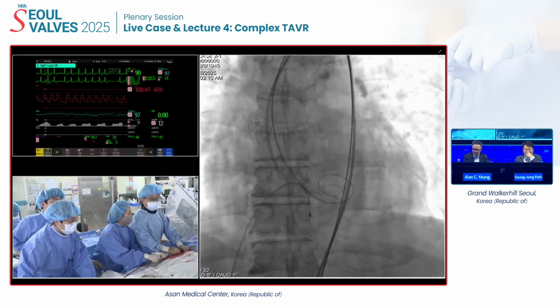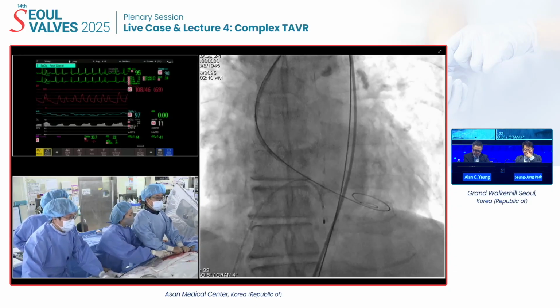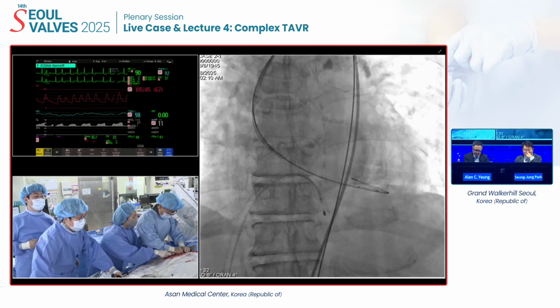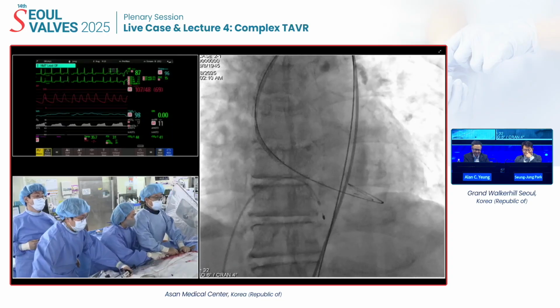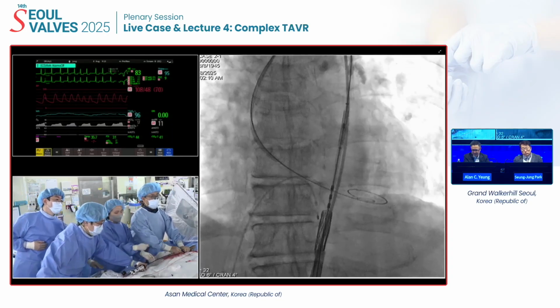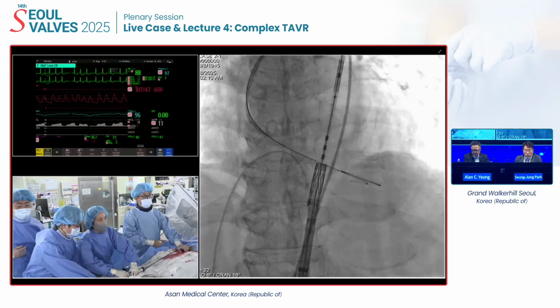Okay, going in. Okay, check it out. This is a Sapien 26.